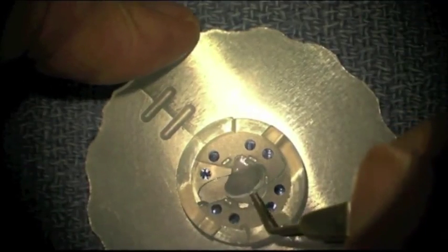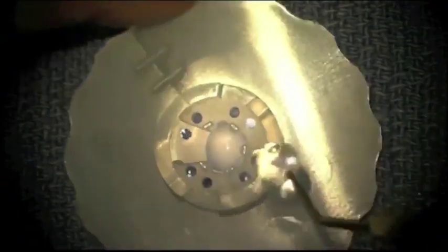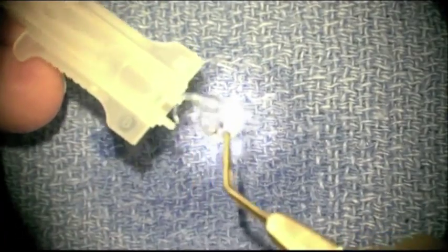Then grasp the intraocular lens at the haptic-optic junction and confirm the orientation of the intraocular lens with the picture on the back of the cartridge. Make sure it's in a backwards S configuration. Place the intraocular lens in the cartridge.